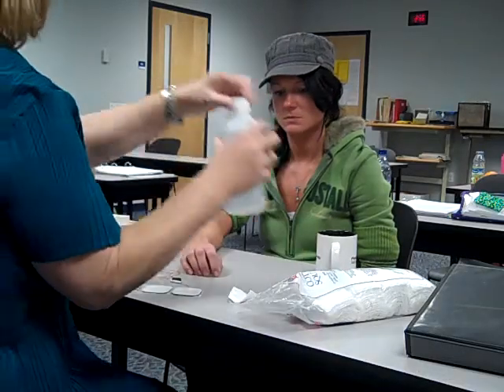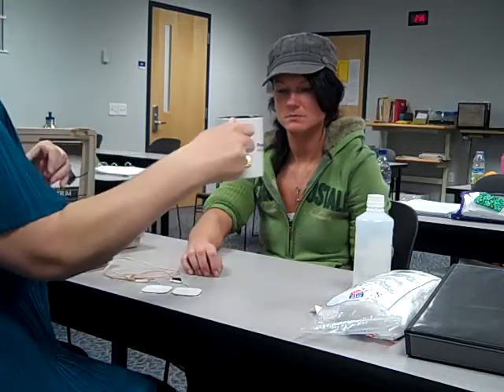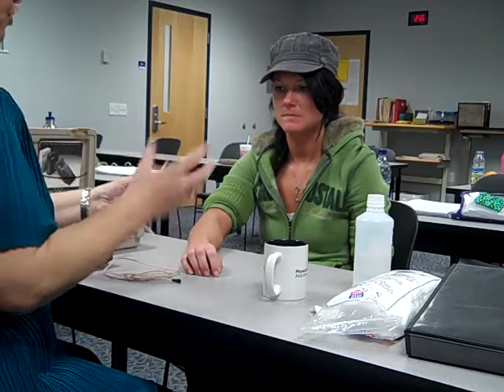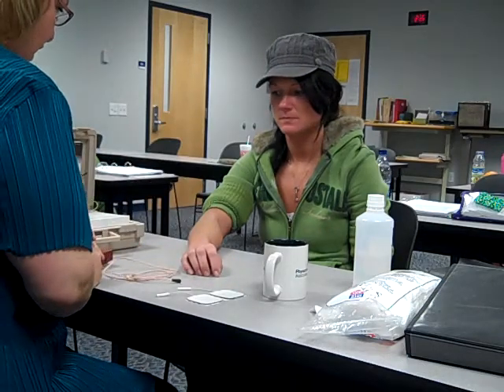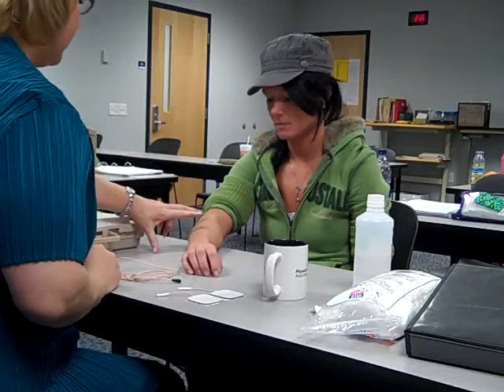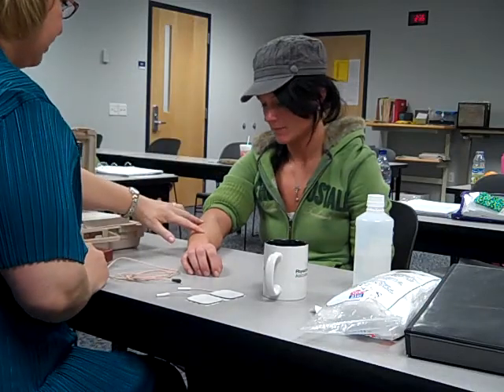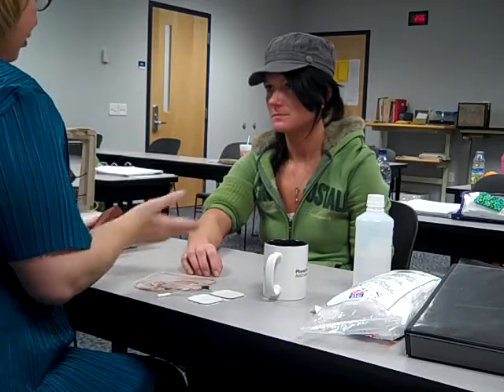Make sure you put the lid back on the alcohol because it evaporates. I also have a cup of water here in case I need to work on the electrodes — sometimes they lose their stickiness, and you can regenerate that with water. I'll show you how in a few minutes. So that area seems to be dry now. We're going to put the electrodes approximately here and here — it varies with every patient depending on where their pain is.